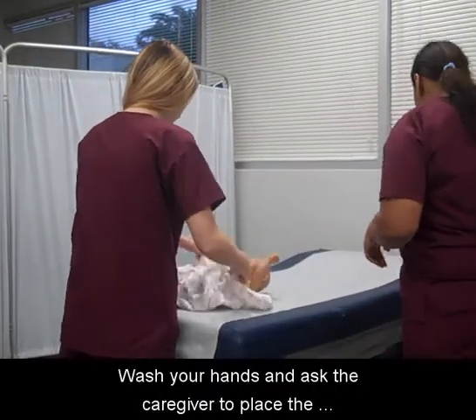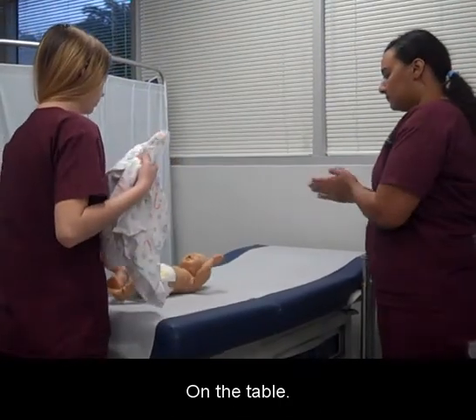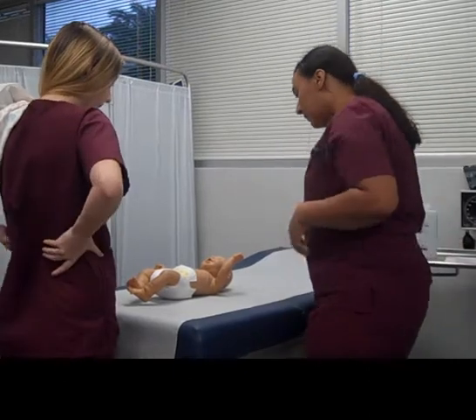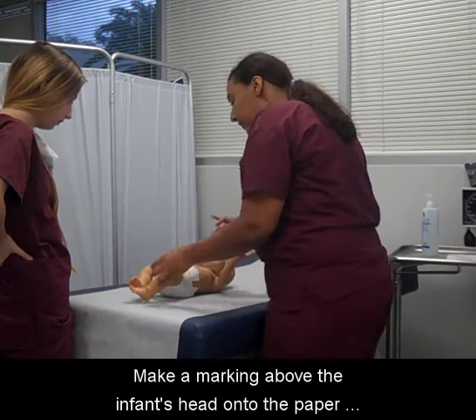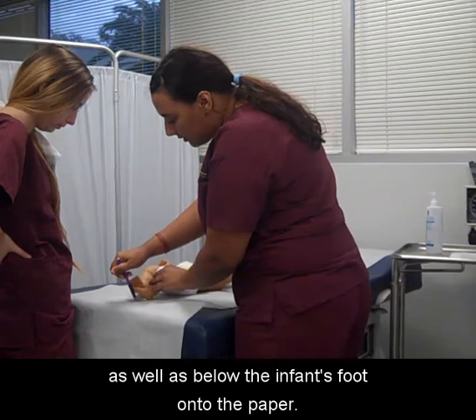Wash your hands and ask the caregiver to place the infant on his or her back on the table. Make a marking above the infant's head onto the paper as well as below the infant's foot onto the paper.